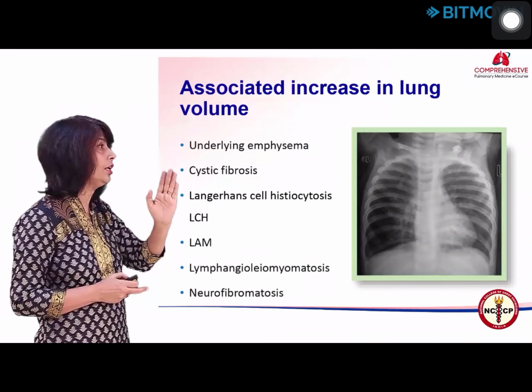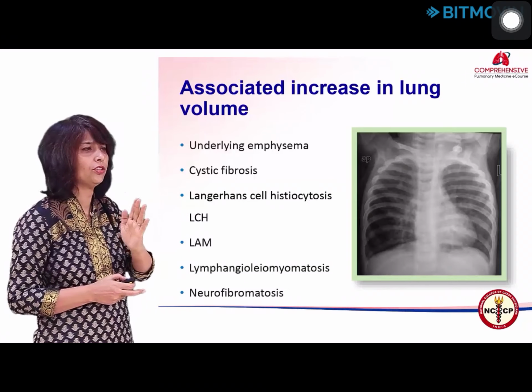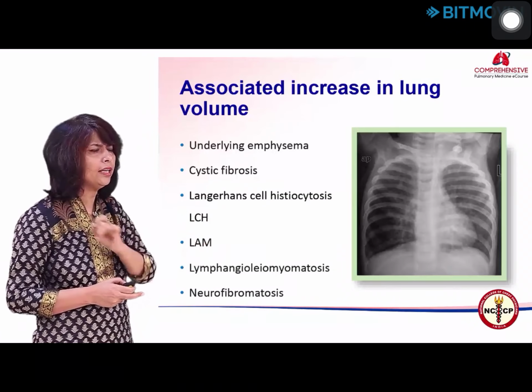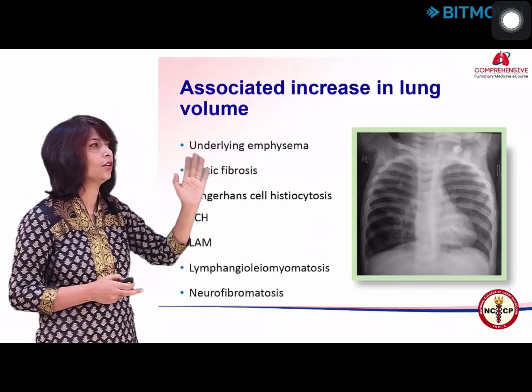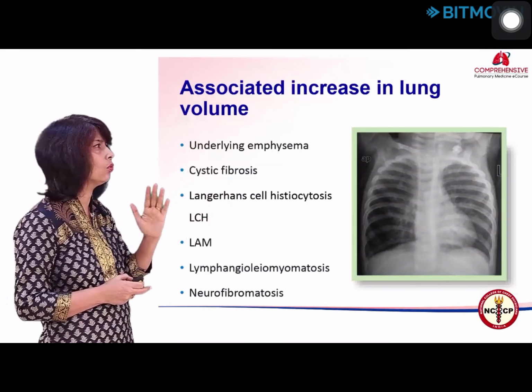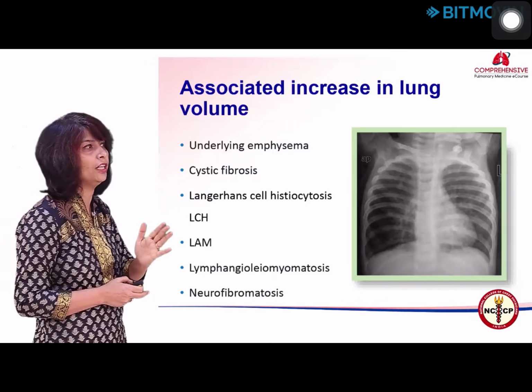So the utility is you can put up 6 radiographs, and whenever I do film readings, especially when patients come who are 20 years old, 30, I say bring chest radiographs from the day you were born, and it completely changes the diagnosis. So you cannot have so many sequential CTs. Another good thing is in ILD, looking at the lung volumes. You can quickly see the chest radiograph and see at what rate the lung volumes have been diminishing.